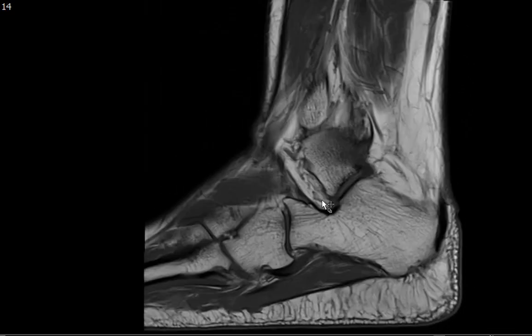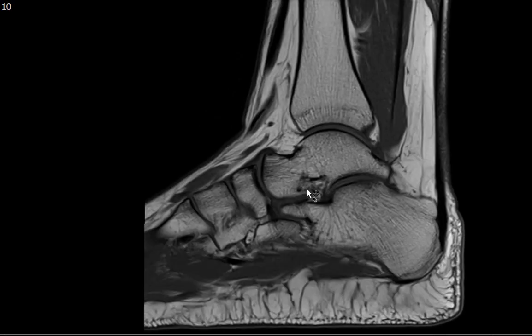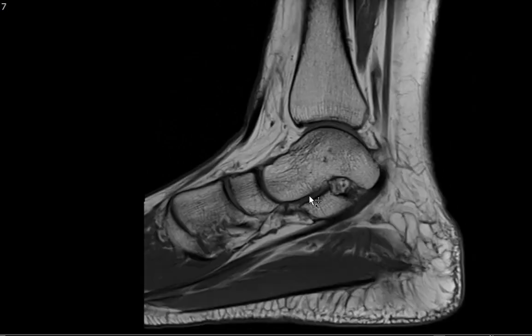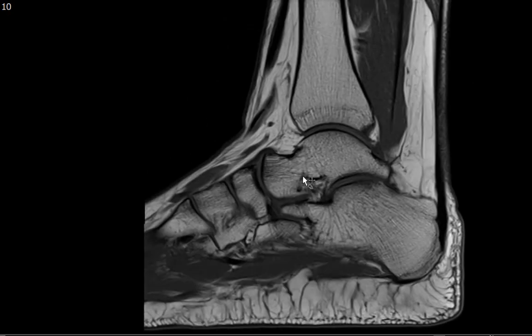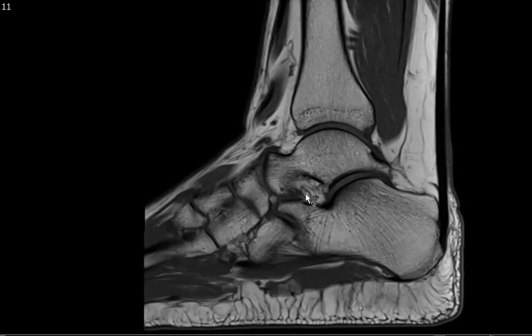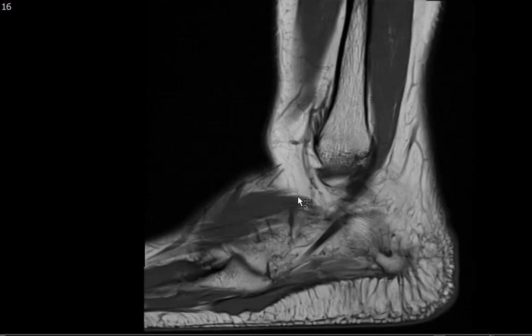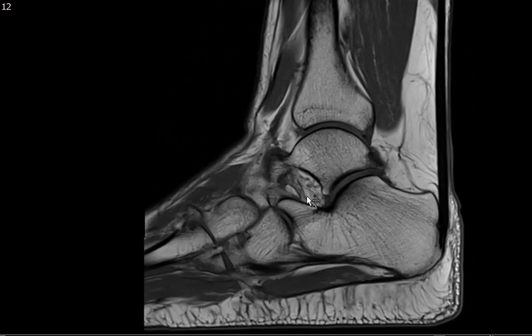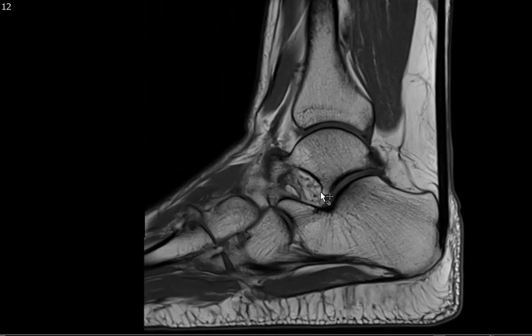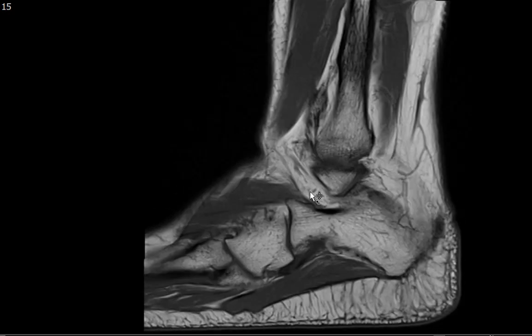Since we're on the sagittal, I want to point your attention to the sinus tarsi — this space right here. There should be nice fat coursing through it, because if the fat is replaced you would consider sinus tarsi syndrome, which can be caused by a ganglion cyst, a mass, or fibrosis. Structures running through the sinus tarsi include the medial, lateral, and intermediate roots of the inferior extensor retinaculum, the cervical ligament, and the talocalcaneal interosseous ligament.